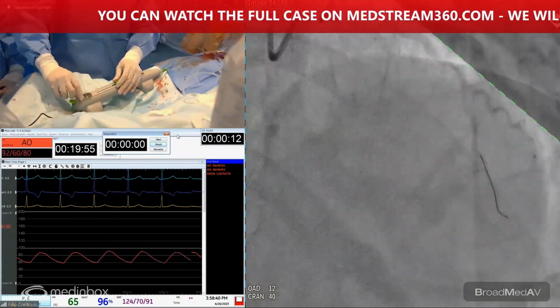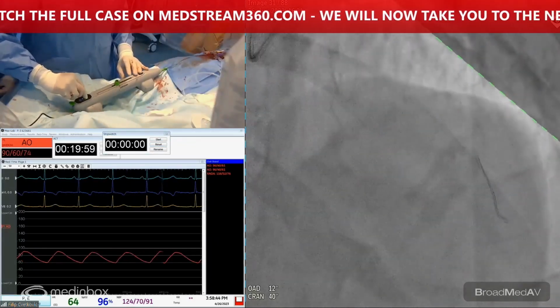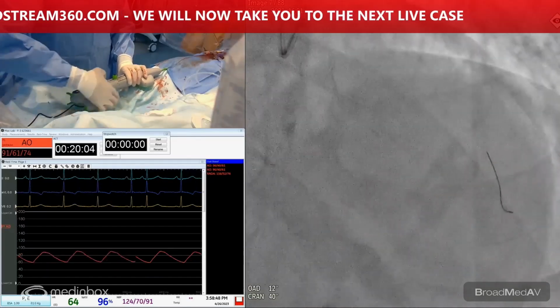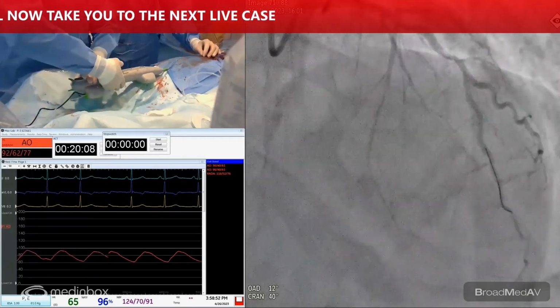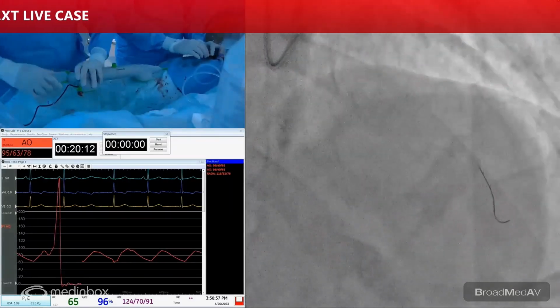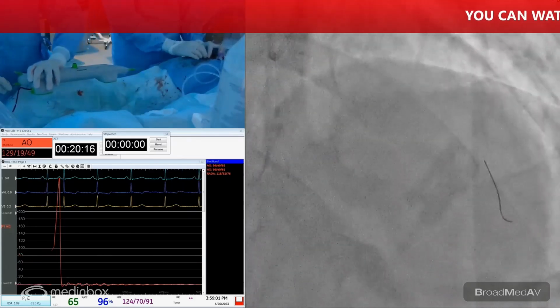All right. So I hope the RCA was educational enough. And I still have a lot of work to do. Continue. So we'll go on glide assist to remove the burr, open up, fluoro. Make sure you have a good look on that wire, not to lose position.